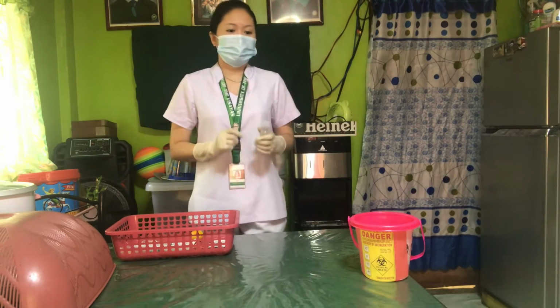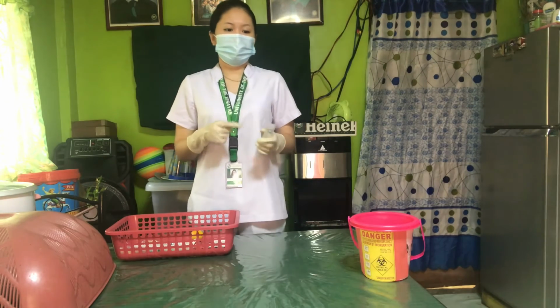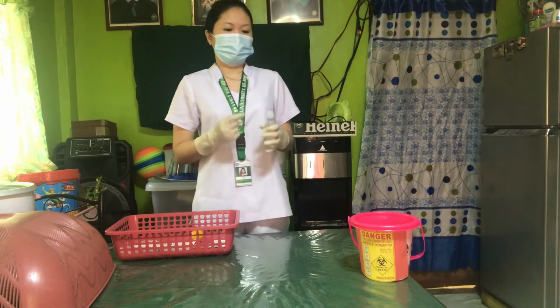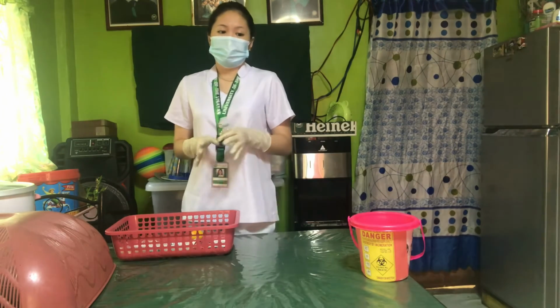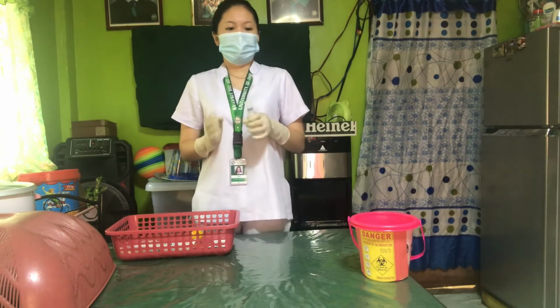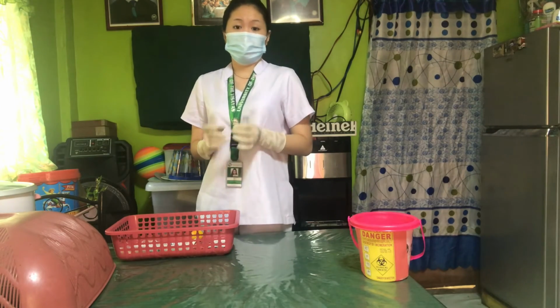Next is remove the protective cap or clean the rubber cap of a previously opened vial with an antiseptic wipe by rubbing in a circular motion. The antiseptic cleans the cap and reduces the number of microorganisms.